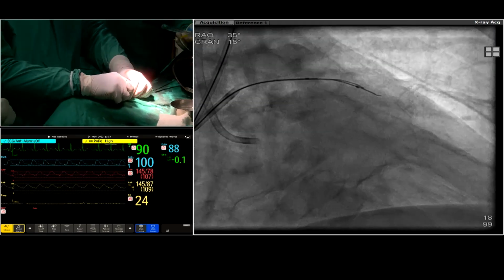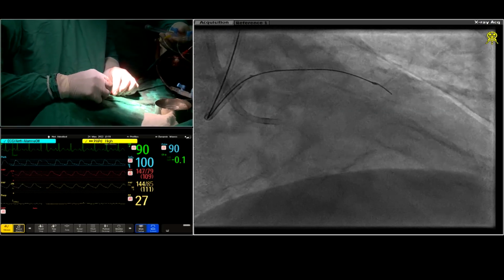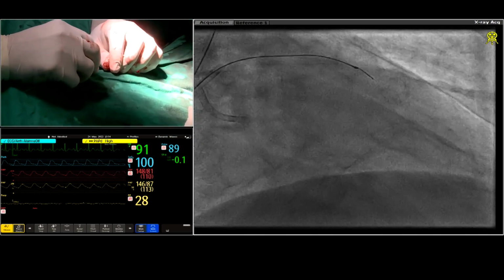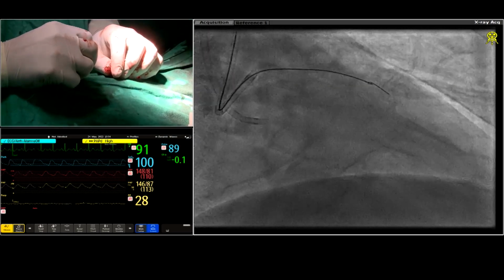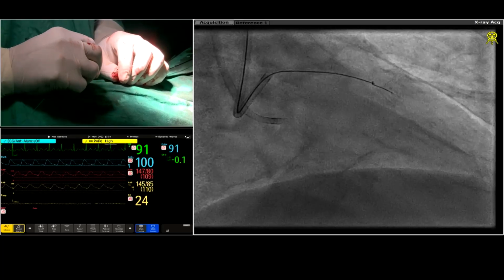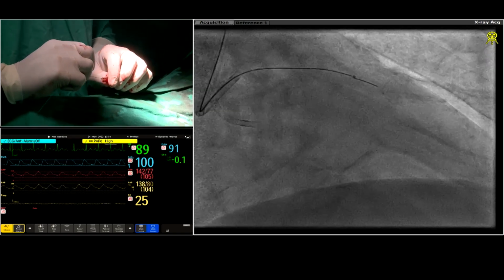I need the trapping once again. ये क्या रह गया है वहाँ? हाँ, there is a coiling of this wire. It was buckling at that place, so that is the issue.